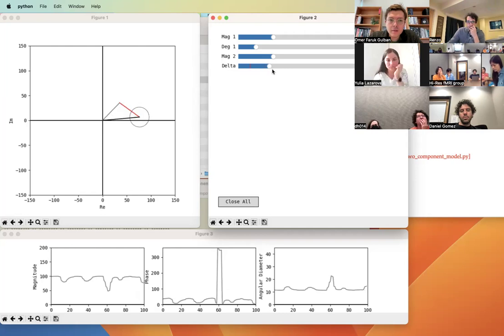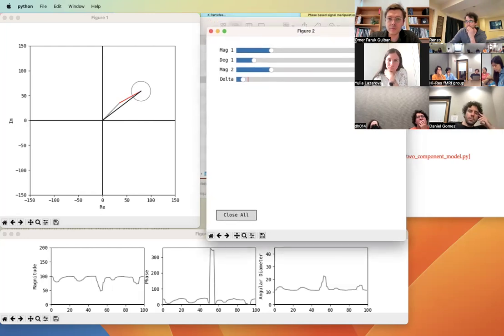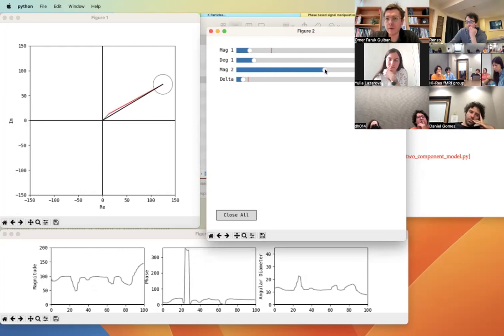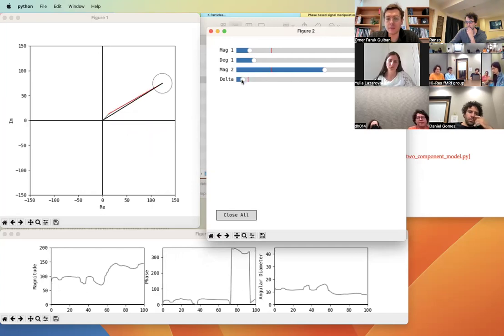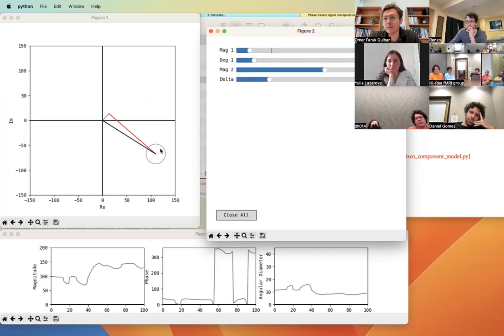So okay, like deoxygenated, oxygenated, and hopefully you see this geometric relationship. Now another part of this geometric story is the following. What if we have very little gray and a lot of red vector? That is like a heavily pial vein dominated voxel. So now when the deoxygenation changes, let's say 90 degrees, like the same amount as it was changing previously, the resulting phase change in the black vector is really large.